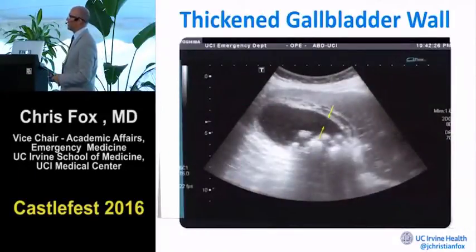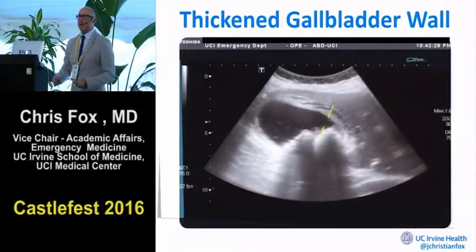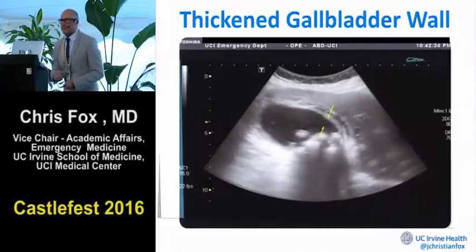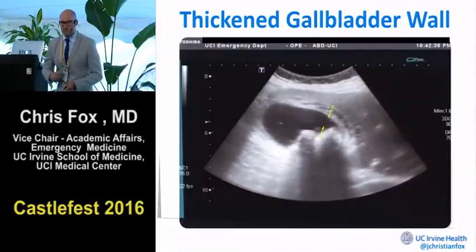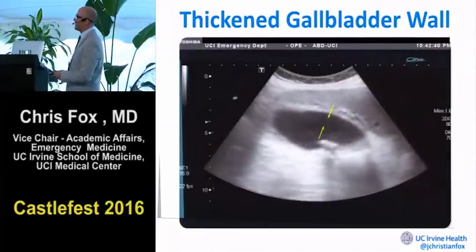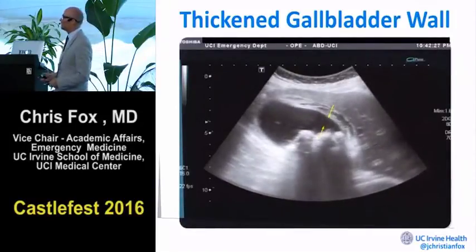So when you worry about acute cholecystitis, we think about there being a very thick outer wall to our gallbladder, stones, shadowing. And if you were doing the ultrasound yourself, as you lean in with the ultrasound probe, the patient would say something like, yep, that's it right there. That's the pain that brought me to your ER. I love when they say that. So the sonographic Murphy sign is very, very specific for this being acute cholecystitis.